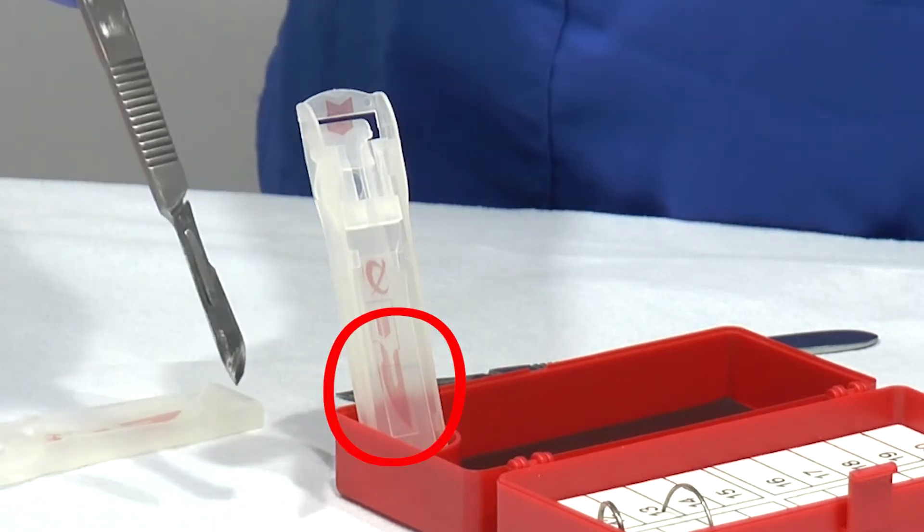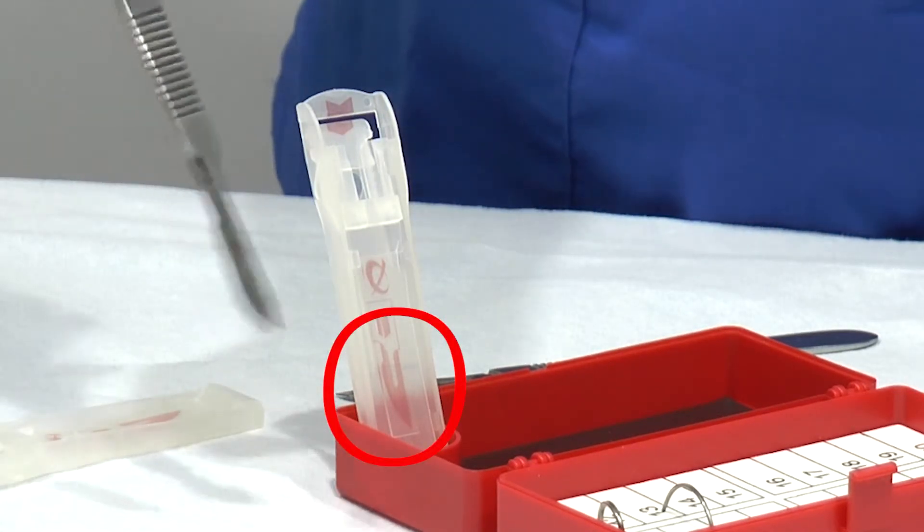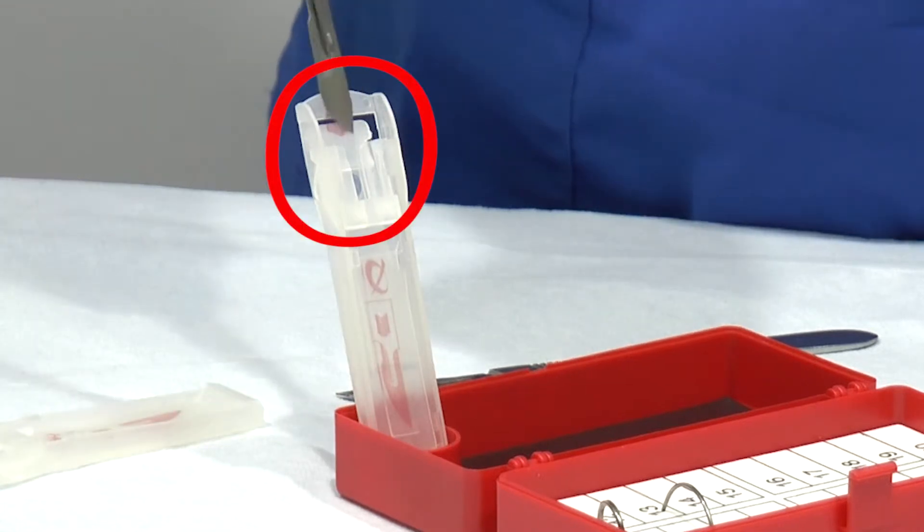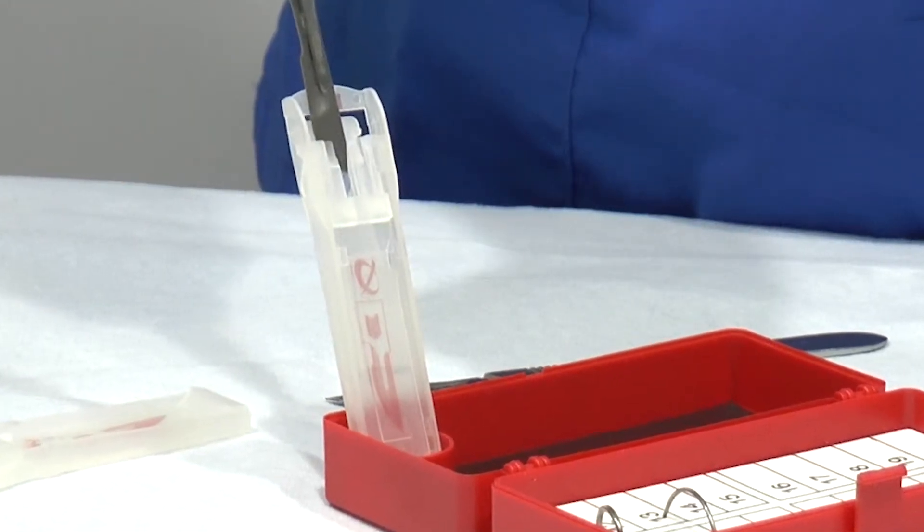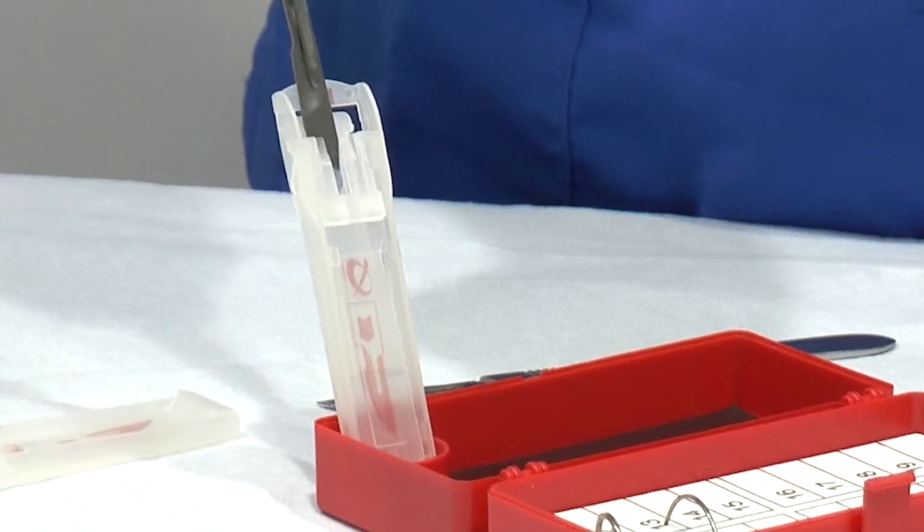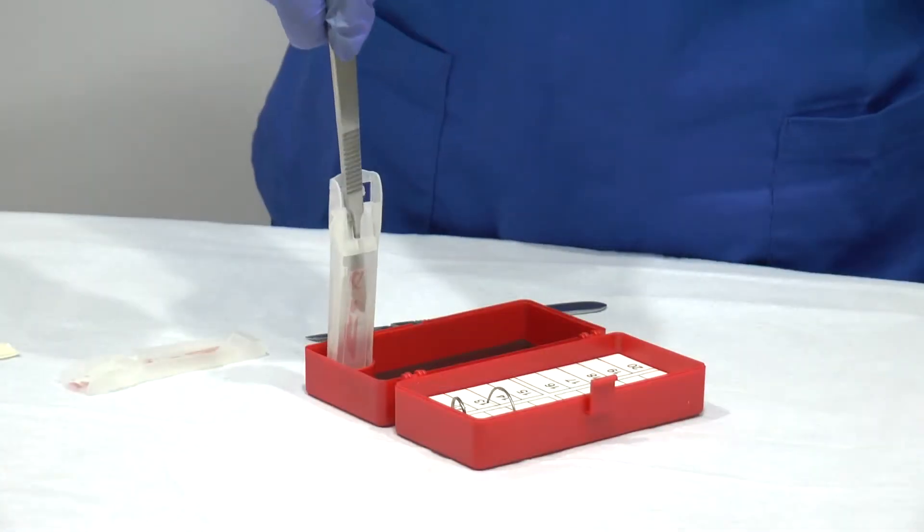Using one hand, press the scalpel blade on the red landing pad and insert it under the jaws of the cartridge. This will help guide the scalpel into the correct placement. Tilt up to 90 degrees and then push the scalpel down until you hear a click.